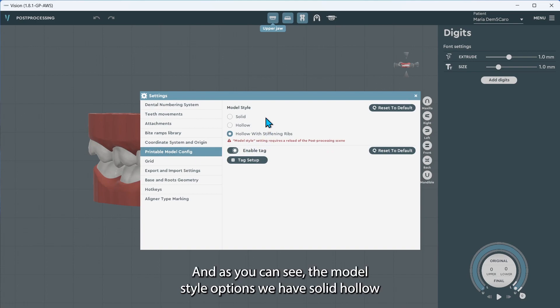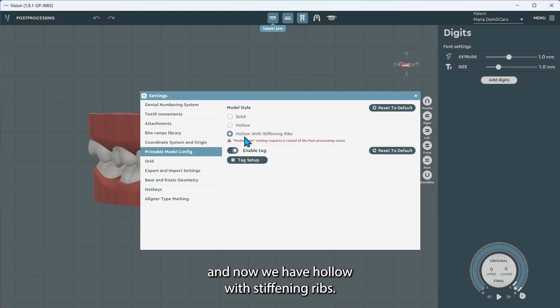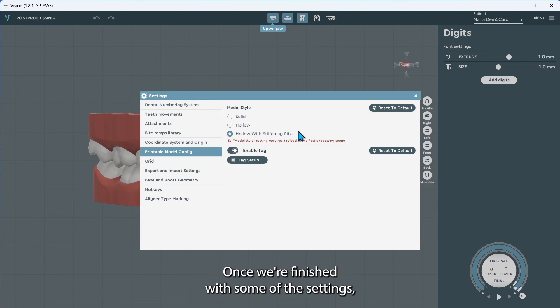As you can see, the model style options we have are solid, hollow, and now we have hollow with stiffening ribs. I'll show you what that looks like once we're finished with some of the settings.